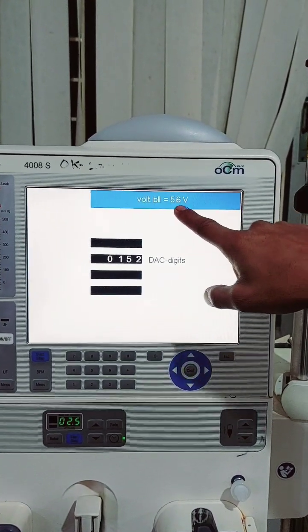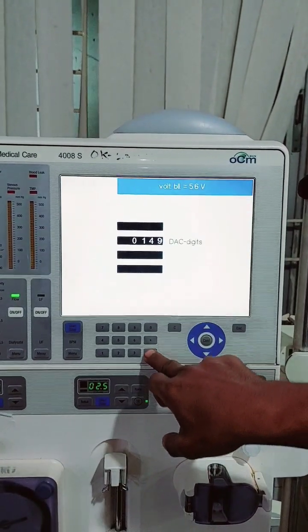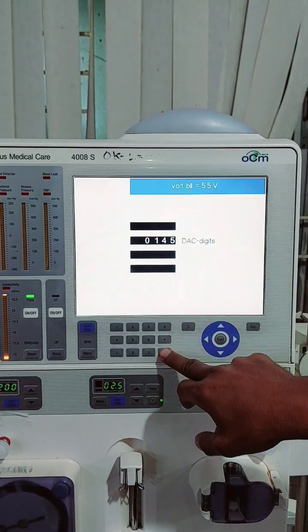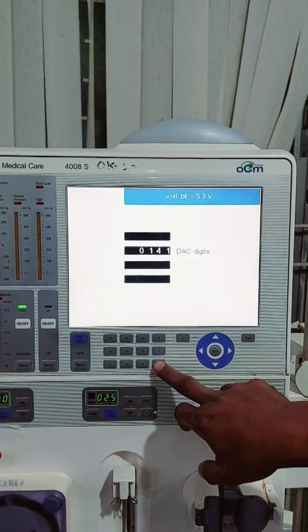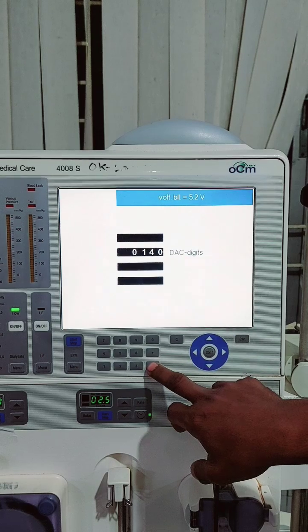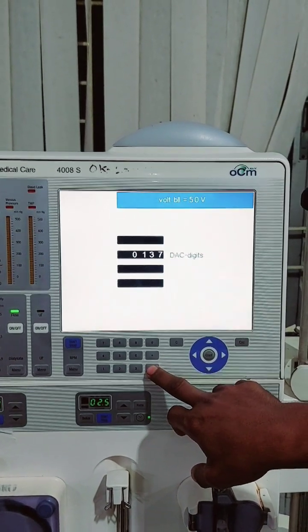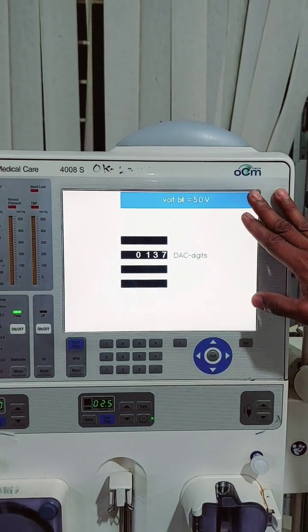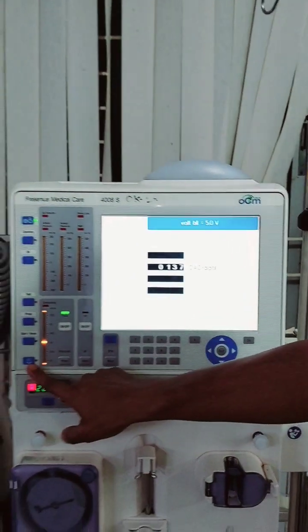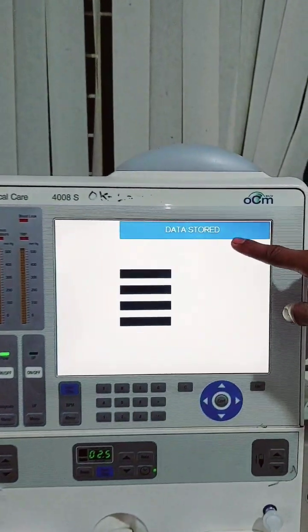We need five volts. Good — five volts. Now we store this key. Place the key and store this valve.